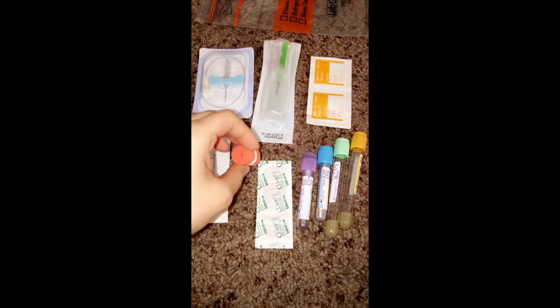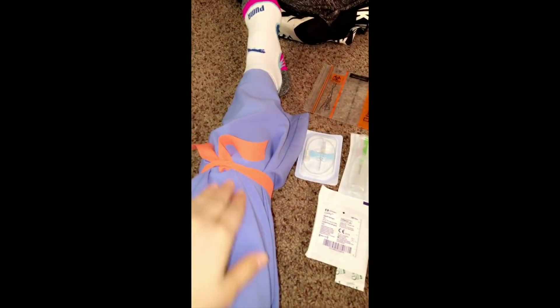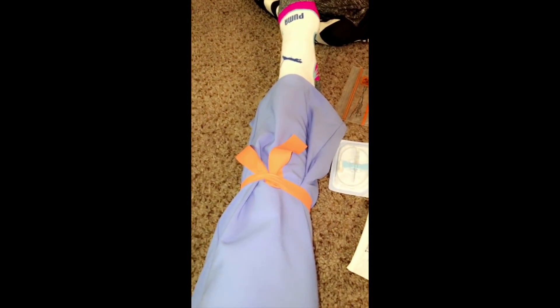Tourniquet — do you guys know what a tourniquet is? Let's talk about it. A tourniquet looks like this. We're going to be doing it on my leg so that you guys can see — pretend that this is an arm. What the tourniquet does is it stops the blood flow in the vein. When you stop the blood flow in the vein, it helps you as the phlebotomist to allow that vein to engorge with blood so you can actually find it and be able to poke it. So I want to show you guys how to tie a tourniquet. Pretend this is the shoulder, this is the upper arm, this is going to be the elbow, and this is going to be the forearm. The best place to get a good vein is going to be right in the elbow crease — it's called the median cubital area. But you're going to want to put your tourniquet a couple of inches above that so you don't block the vein that you're trying to get.